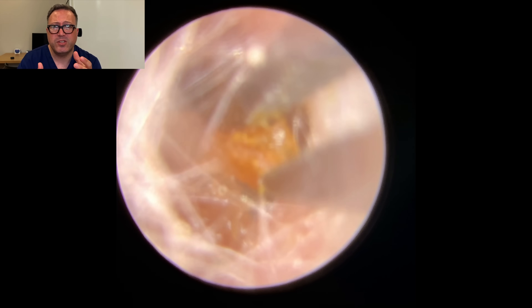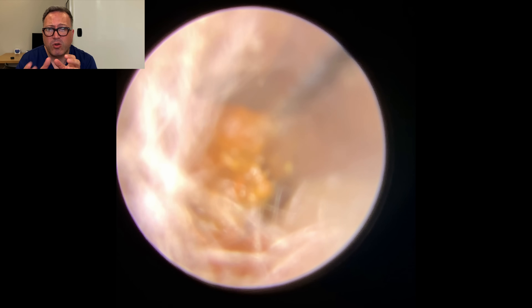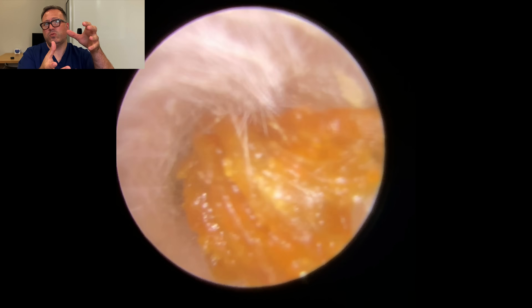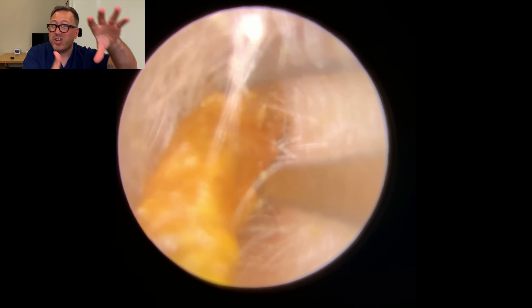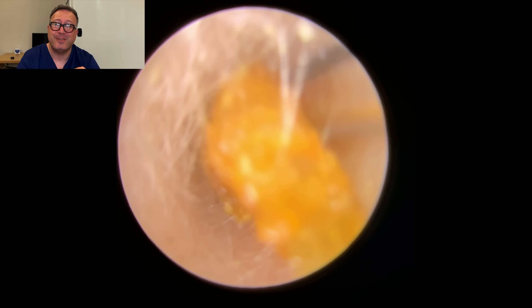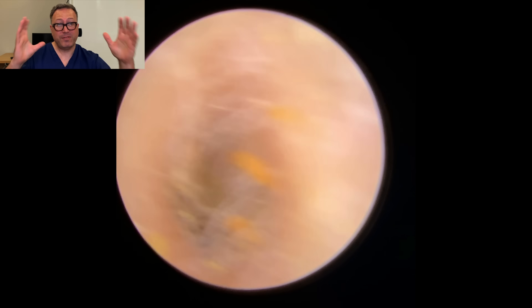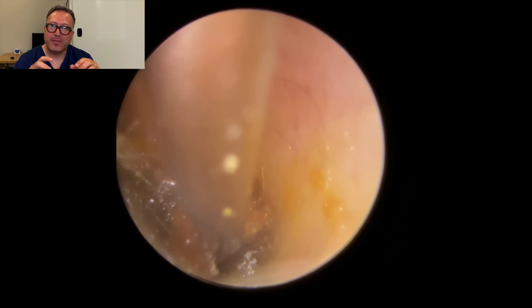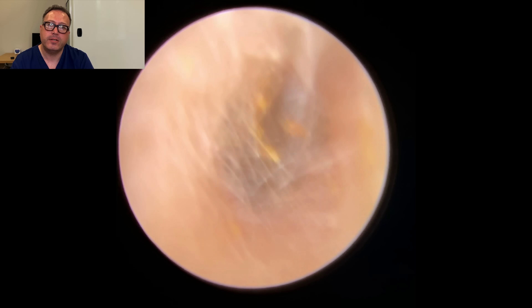So we've pulled that piece through — we can just about get the crocodile forceps there on the outside edge, so we'll get a good grip. Hopefully we've got hold of that piece of skin — if we have, what you'll see here is that whole concertina section coming away. We almost got another really long ribbon there — you can see the end of it just sheared off. I was hoping we were going to get this one out as one long piece as well. Look at that coming away — just imagine if that had stayed connected, that would be a really, really long piece. So we've got what's behind that now — that skin debris had been trapping this piece of wax behind it.